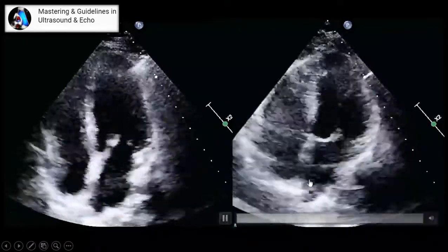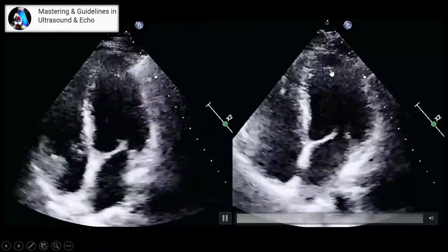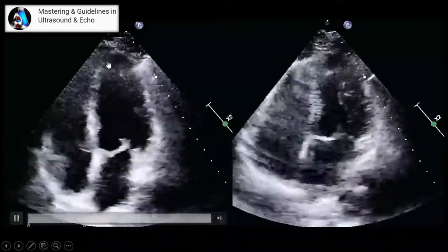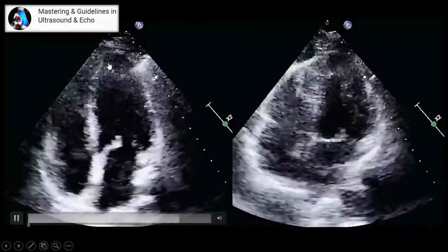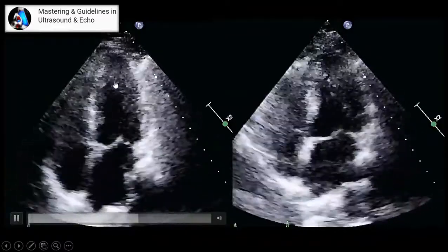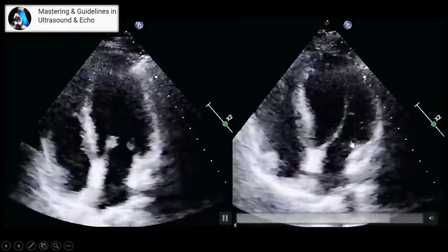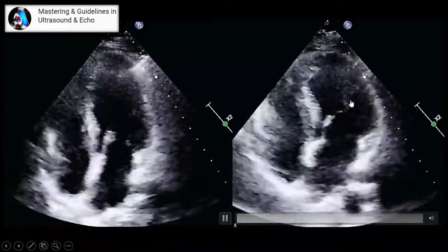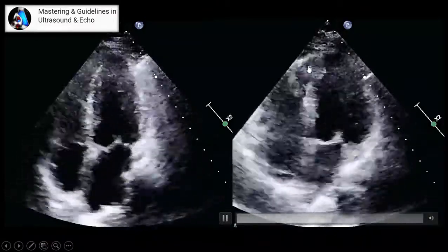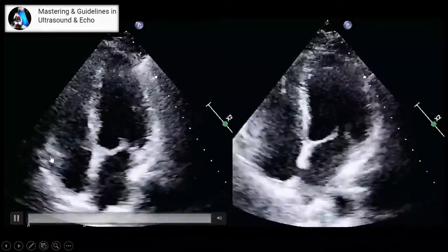You will see this oval-shaped endocardium apex is very thick, and especially during systole becomes very thick, but here the endocardium changes only a few millimeters during systolic phase, and the left ventricle is completely bullet shaped. Here it is less bullet shaped, and the heart's overall shape is more round compared to the oval and bullet shape of the heart.